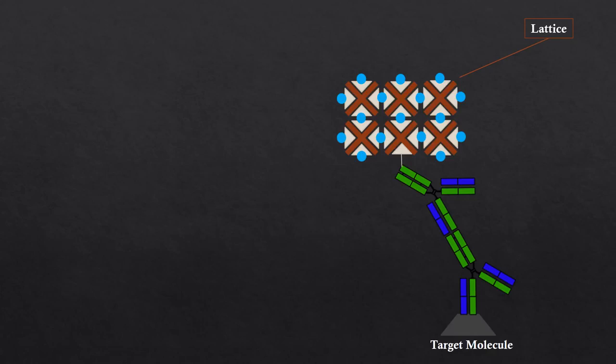The secondary antibody used to locate the primary antibody is also biotinylated, so that the lattice can attach itself to the secondary antibody. Thus, the ABC method increased sensitivity by adding a humongous amount of label molecules to the procedure.